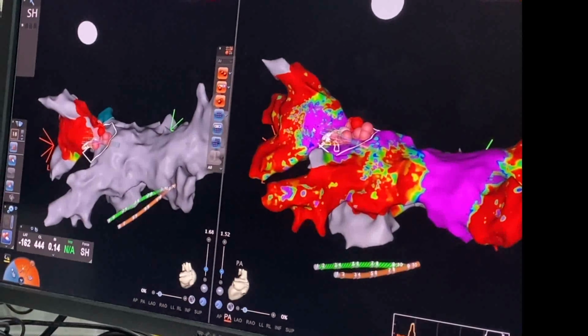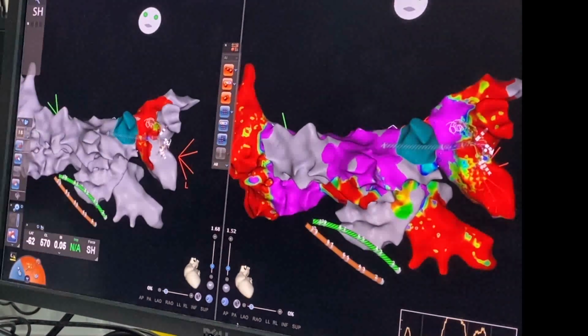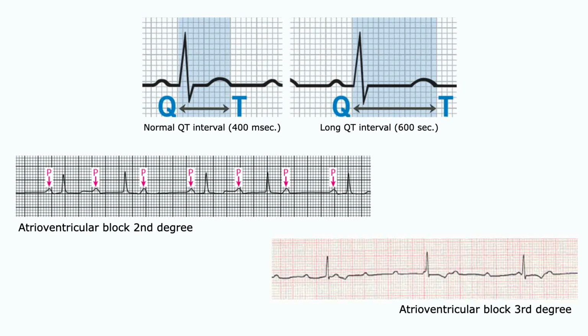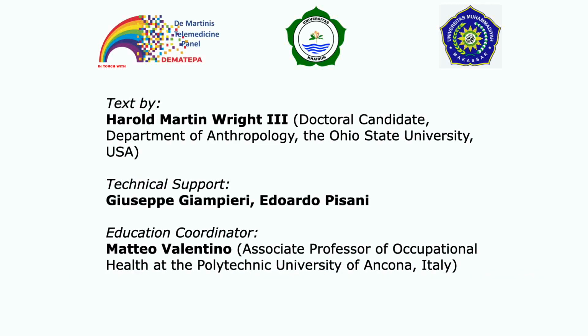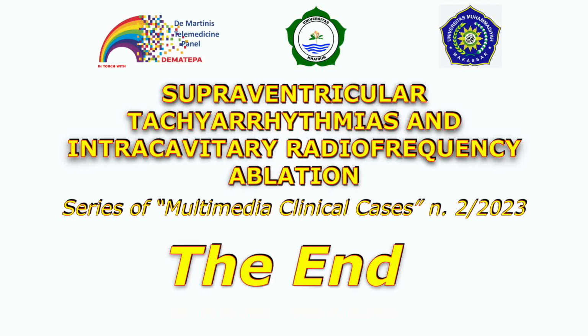Intracavitary electrophysiology studies and radiofrequency ablation of short-circuiting re-entry pathways, which keep up atrial fibrillation, is a safe procedure. The long-term ineffectiveness of some antiarrhythmic drugs and their adverse reactions, including both QT interval prolongation and conduction blocks, suggest extending such therapeutic maneuver to elderly patients and therefore curbing myocardial deterioration. But this recommendation is applicable whenever the myocardium is mechanically effective, no structural valvular defects are present and risk factors for atherosclerosis are under control.